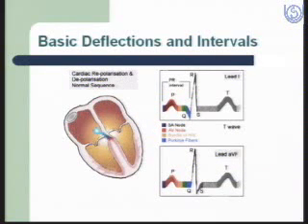And how are they produced? As all of you know, the normal pacemaker of the heart is situated in the sinoatrial node, which lies at the junction of the SVC and the right atrium. It causes depolarization of the atria, and this depolarization produces the P wave.